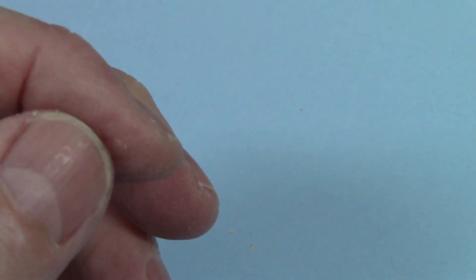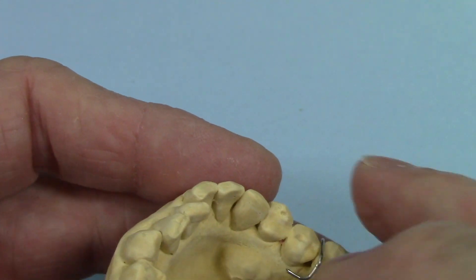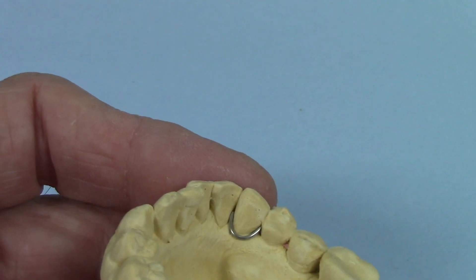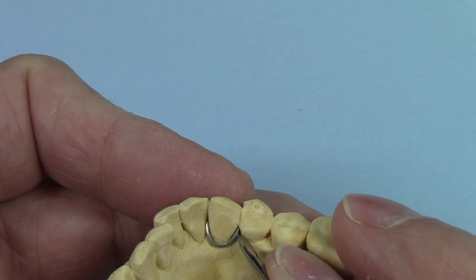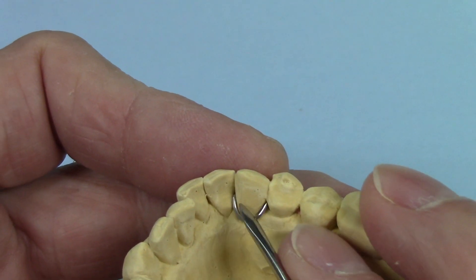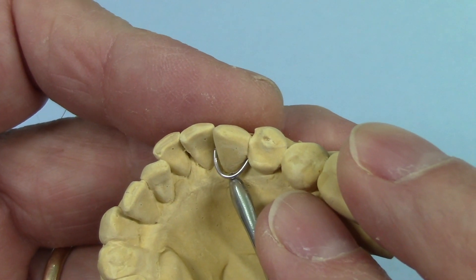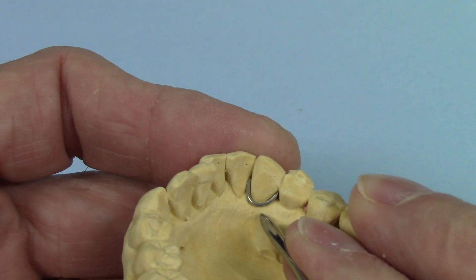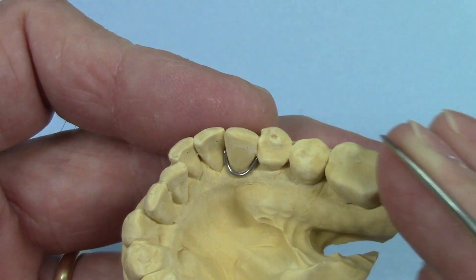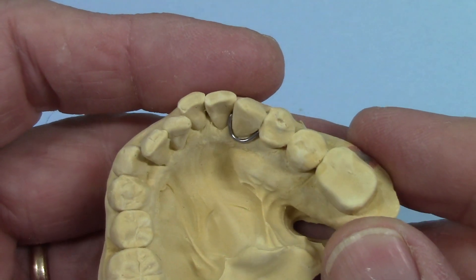Another way this clasp can be used: there's an appliance called the ALF appliance — A-L-F, or Advanced Light Force — and it uses modified Crozat clasps on the cuspids. What I do on that is taper the ends of the wires, roughen it up where it's going to be soldered, put a little dollop of wax there, and then you can lift it up. Put your lingual wire underneath it, then put the heat protective compound all the way up to the solder area. That leaves a lot of room to engage into the embrasures of the lingual of the cuspid.